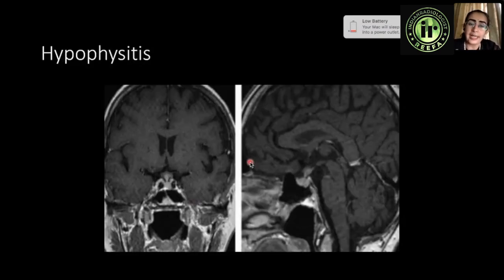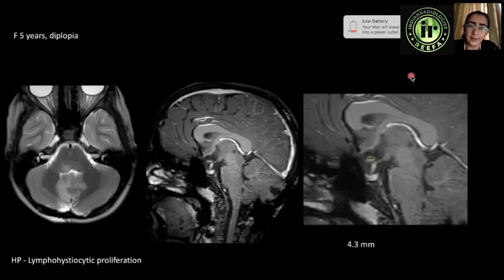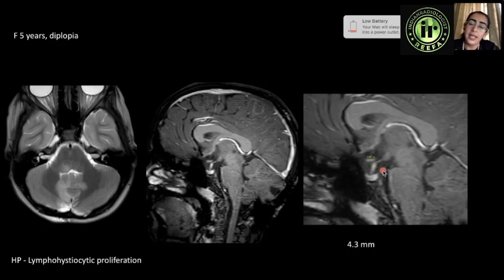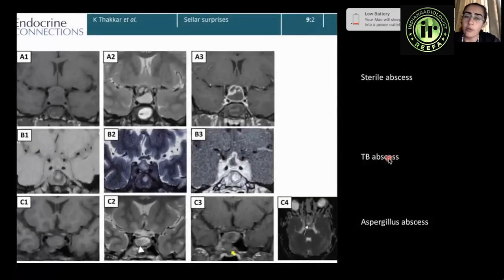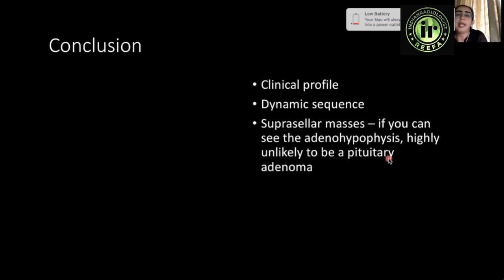In patients with diabetes insipidus, the posterior pituitary bright spot may not be seen, or there may be intense enhancement of the infundibulum in hypophysitis. On T2-weighted images, T2 hypointense signal in the periphery is seen in autoimmune hypophysitis. In a child with Langerhans cell histiocytosis (LCH) and signal abnormality in the cerebellum, the pituitary appeared normal but the infundibulum was mildly thickened at 4 mm — normal infundibulum should not exceed 3 mm. Other differentials include abscesses, infective etiologies, and unusual tumors such as granular cell tumors.